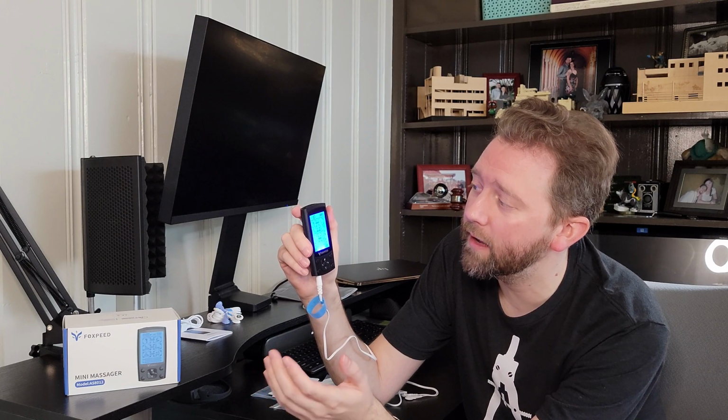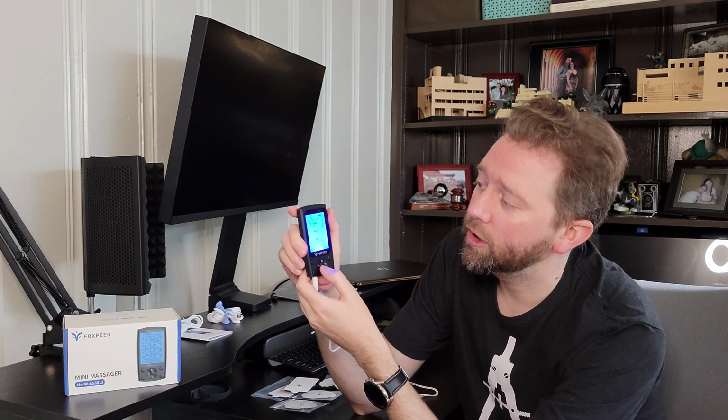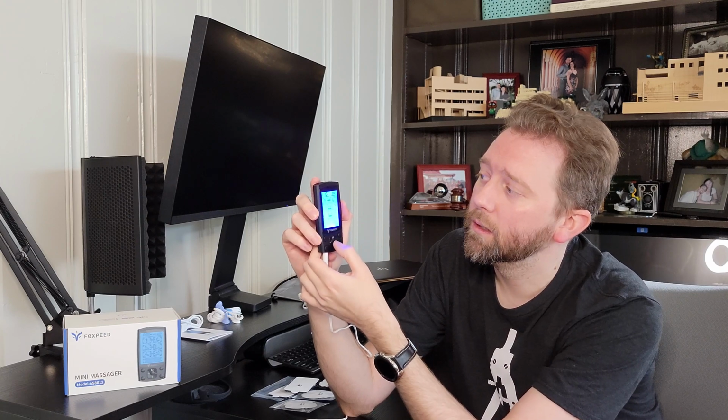So in here, you'll see they kind of have preset diagrams. They got 24 of them. The first one is more for your shoulder pain and all that. I don't know if you can see that really well. And then the other one's designed for your lower body. Then that's the TENS stuff. So you have 8 TENS modes.